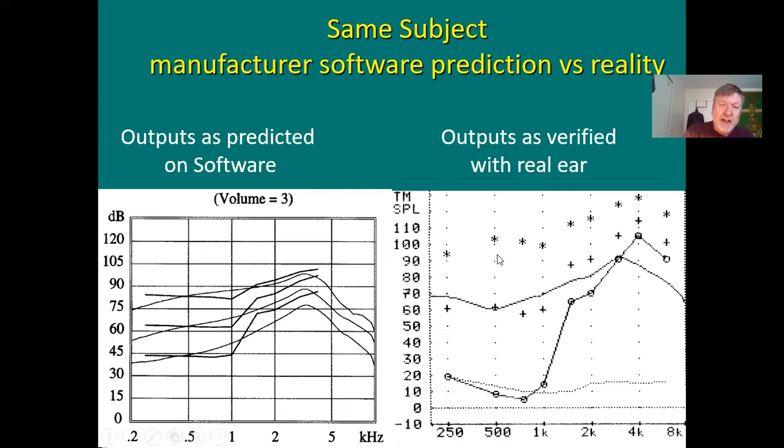But back to this slide, look at the left. You can see that for average inputs, a rosy picture is painted. And when you're looking at real ear, well, you are way off, especially in the highs. I mean, you're not 4 dB, not 14, you're about 40 dB shy here. See where my cursor is, this is what the hearing aid is doing. Okay, so the software said it would be doing this on the left. You're finding out on the right the bitter truth.